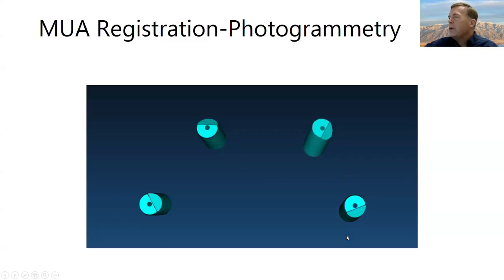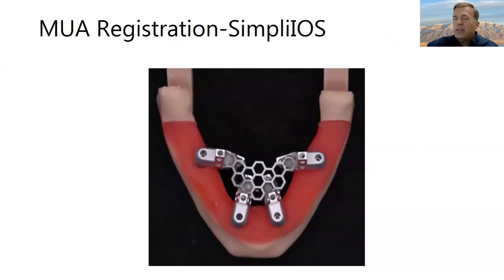In general, with photogrammetry, you'll want to take this scan with the flap open because then you can see and make sure that your scan bodies are seated. The biggest potential for error in this process is the seating of those scan bodies because, again, the scan comes out perfect. With intraoral scanning, some of them have dedicated healing abutments that are used for alignment and some don't. If you don't have dedicated healing abutments, you'll probably want to suture before you take this scan. If you do have dedicated healing abutments like this system does, you can go ahead and take it with the flap open. Keep in mind, because this is an intraoral scan, you'll capture tissue.